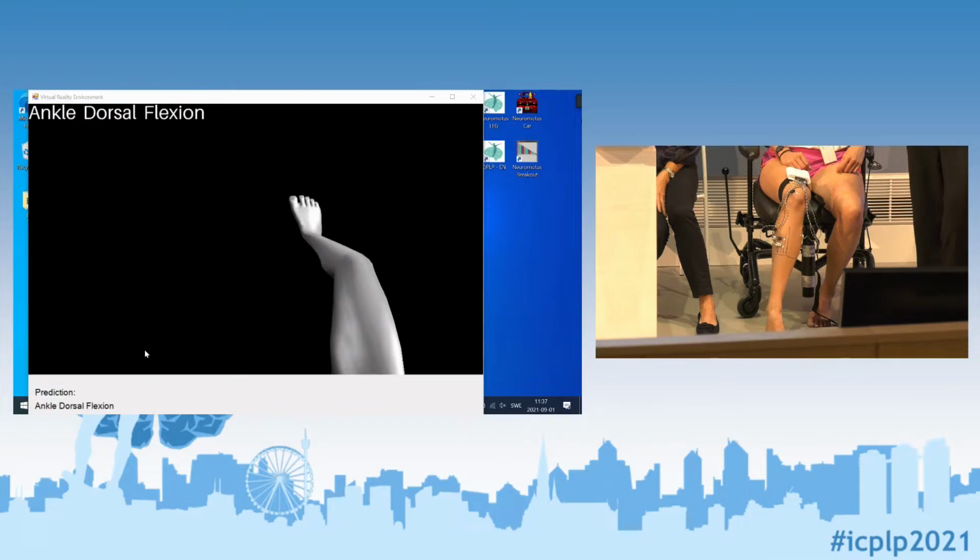So for example, this is quite interesting. Could that happen in life? So for example, now the system recognizes, so we have Mirka's feet, thank God. So we can see that actually how it recognized it was the opposite movement. But the idea is that we actually record the proper movement so the patient can train both. And yes, so this is one of the VR.